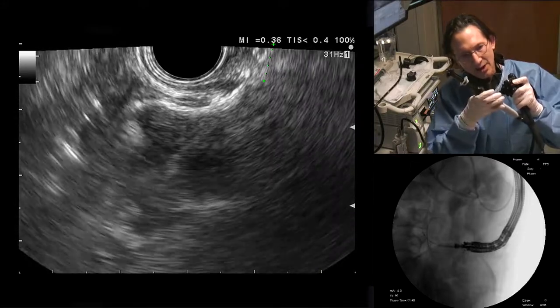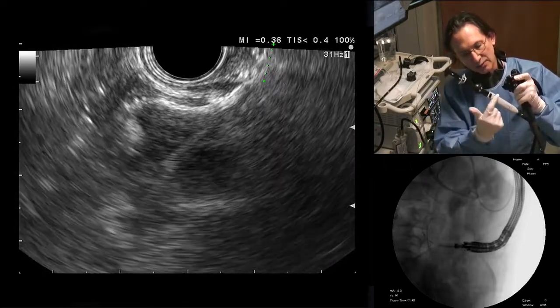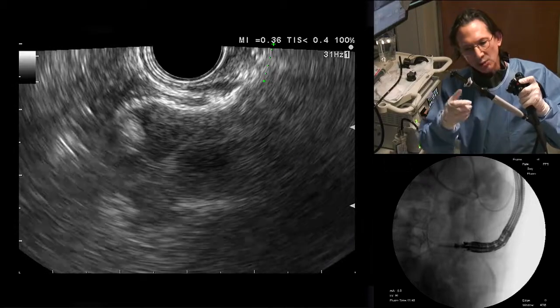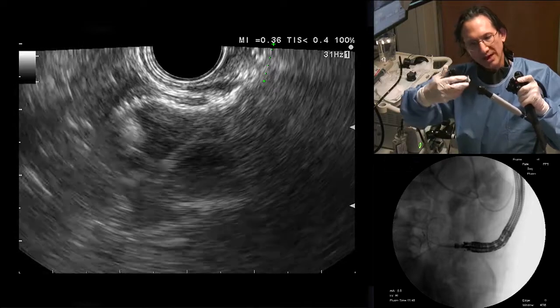Okay? Good. Now I'm going to lock this. All right? So just so that you can see it, it's locked position. So this is the advantage of the swivel. I can just swivel it towards me and swivel it towards you. We can both enjoy the view. All right, now we're ready. It's locked. I've now locked the sheath, and now I'm going to deploy the proximal flange.